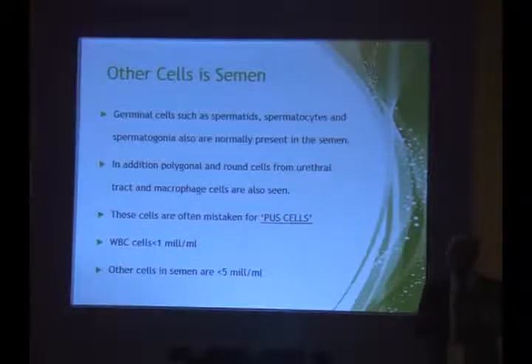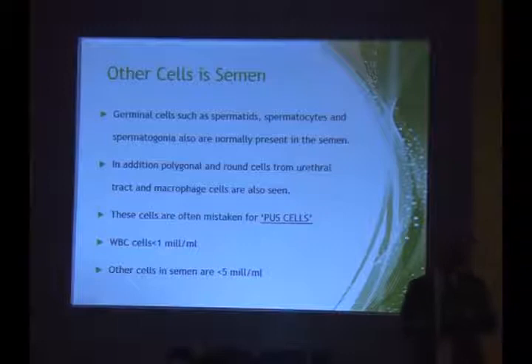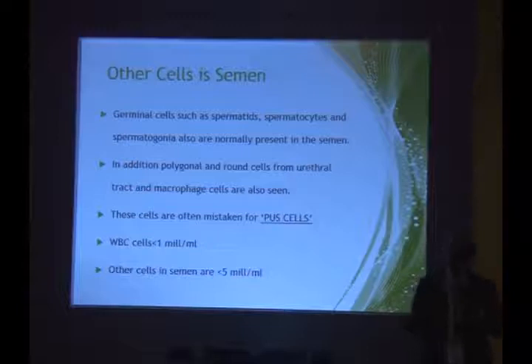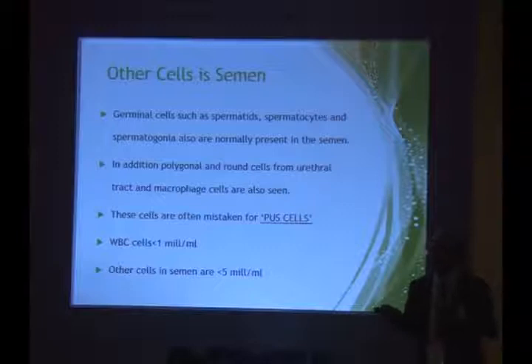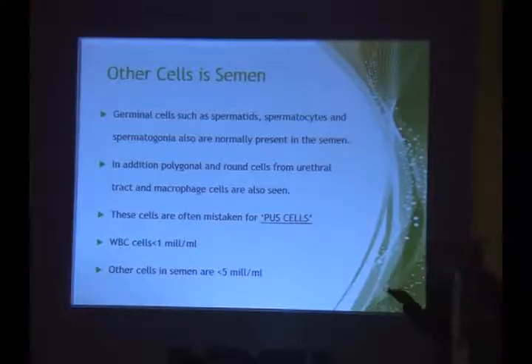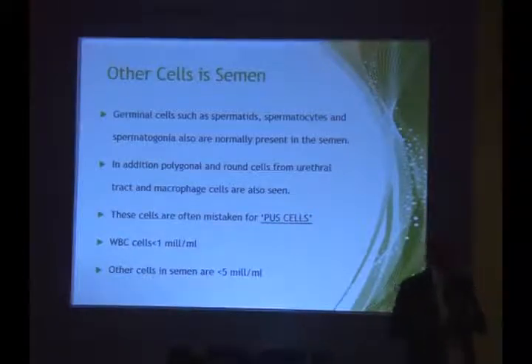Provided you have not mistaken pus cells for spermatids and you have accurately identified, that means there is no physical obstruction, so you are not justified in doing a testicular biopsy of this patient. That's why in azoospermic individuals, if you identify spermatids, it saves the operation for the patient and the referring doctor. That's why it's important. Is it the only importance? No, there is a third additional importance.